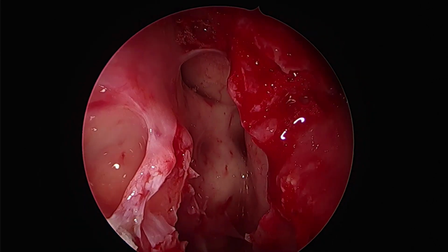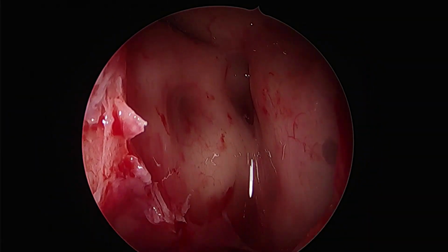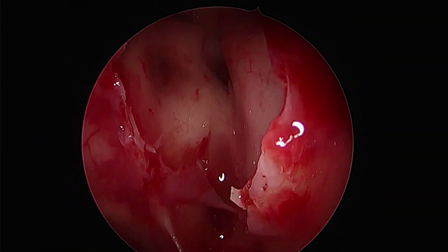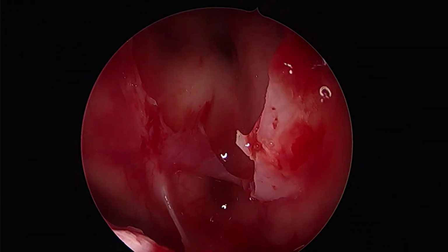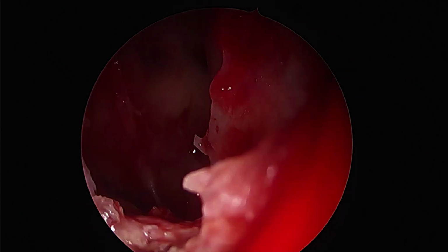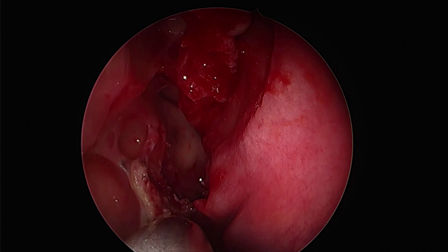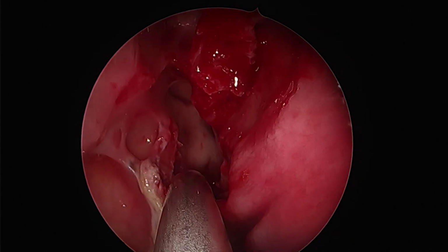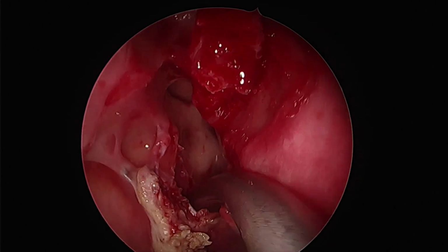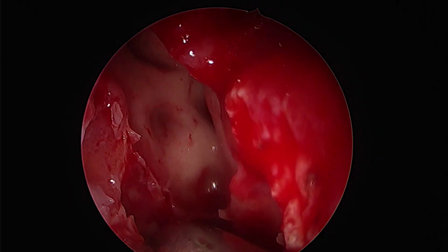Post-irrigation, one can see how well the mucosa is preserved. One must keep it that way. There seems to be no reason to scar this mucosa inside the sphenoid beyond what we have already resected. We can see the start of a pterygoid recess inferiorly, which goes laterally. It's a reasonably well pneumatized sphenoid laterally. The curved suction is going towards the pterygoid recess.